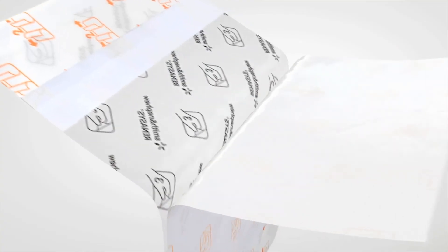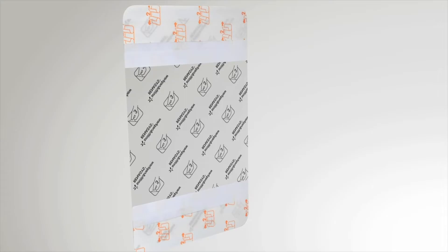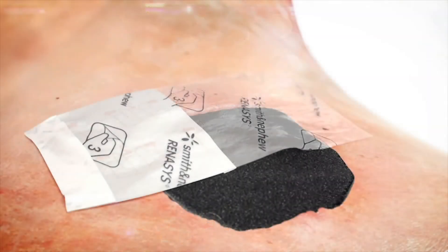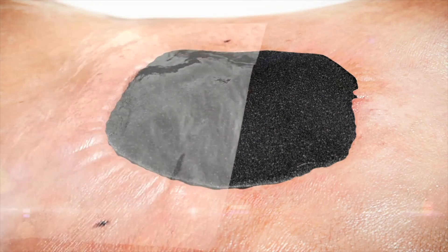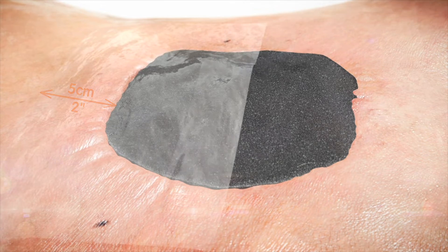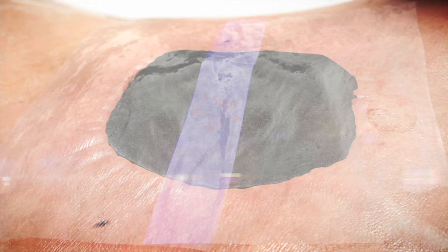While holding the transparent film, expose one side of the adhesive backing by removing a single panel and apply over the wound. Cover the foam with transparent film, removing the remaining adhesive panels to seal, then the top stabilisation panel. The film should extend at least 5 cm beyond the wound margin and be securely anchored to the peri-wound to maintain a good seal. Overlap the edges of the transparent film by a minimum of 7.5 cm when using multiple pieces of transparent film.